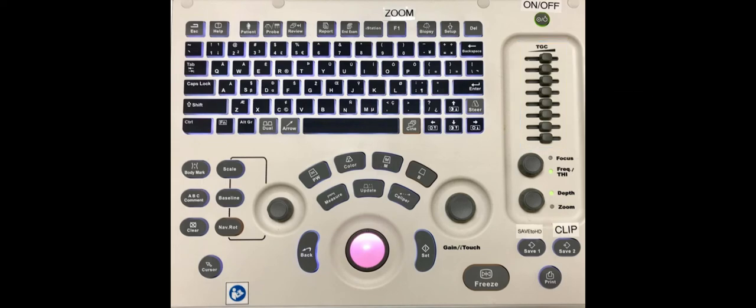TGC stands for Time Gain Compensation. These sliders can be used to change the gain in different depths of the screen. With the auto gain function of this machine, it is usually unnecessary to change these sliders.